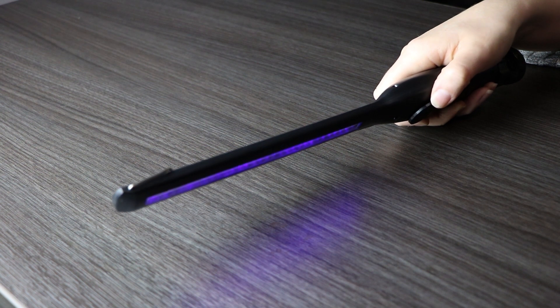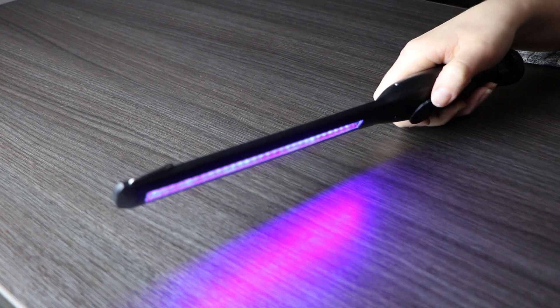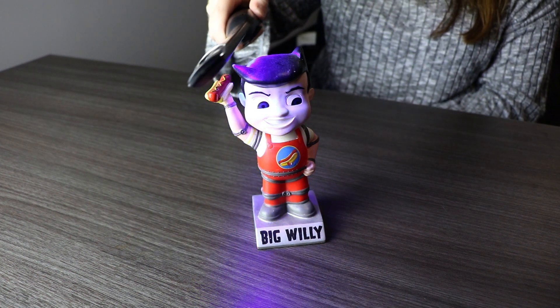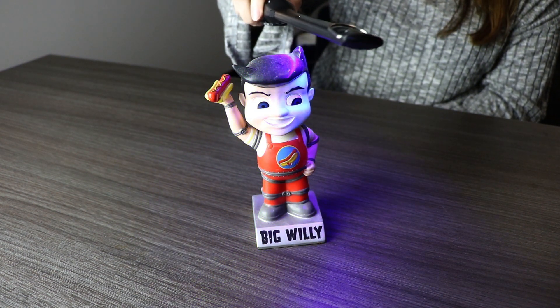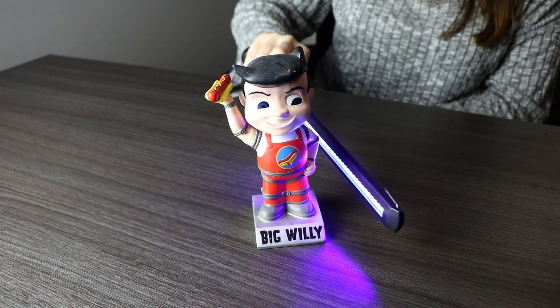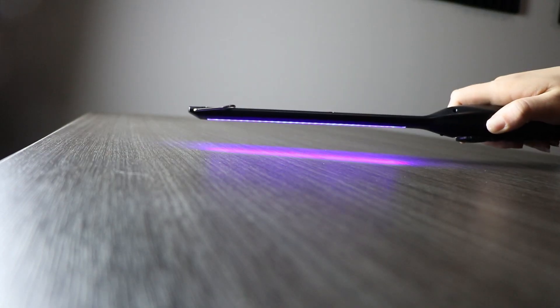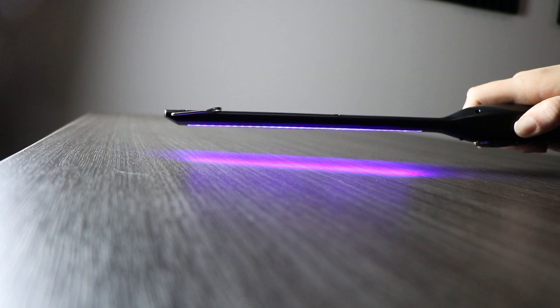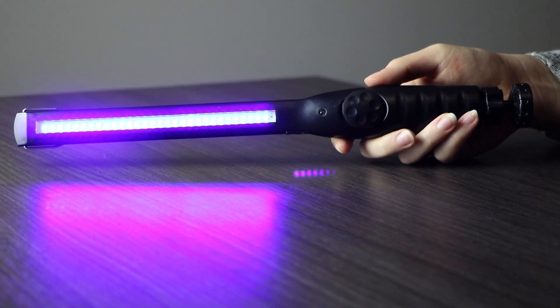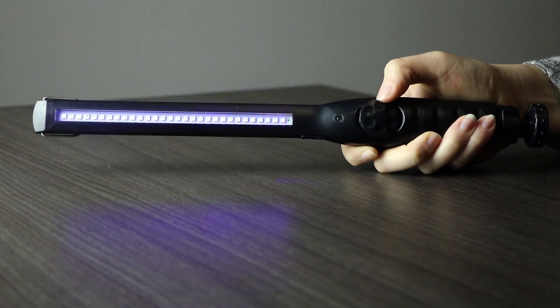To disinfect a surface, you're going to want to crank this bad boy to the max. Hold the wand approximately one to one and a half inches above the object. For small objects or other areas, keep the light on the area for 20 to 30 seconds. For larger areas or objects, move the wand over the area for 15 to 20 seconds. Crank it counterclockwise till you hear the click and you're done — it's just that simple.